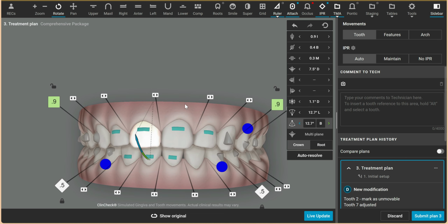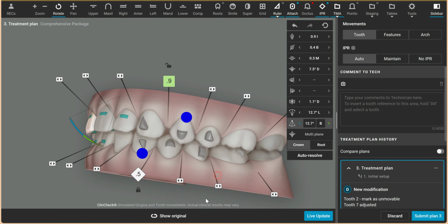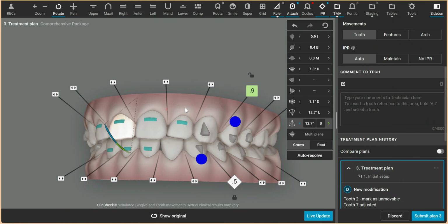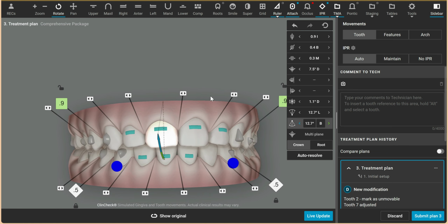The first thing I always do is set the arches. Now, in this particular case, there are some blue movements. There's probably some unnecessary movements in here, but there's no anterior or posterior shifting because I made the second molars unmovable. I do this first, and then I work in the anterior, versus working in the anterior first and not doing anything in the posterior and finding out that there are going to be premature contacts.